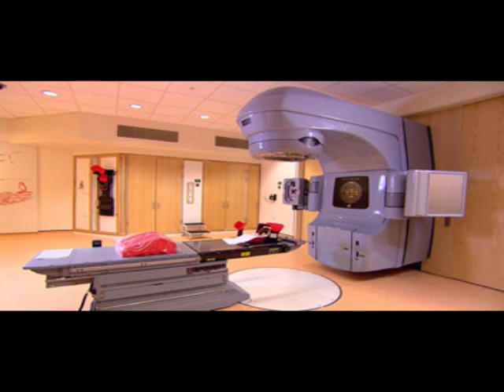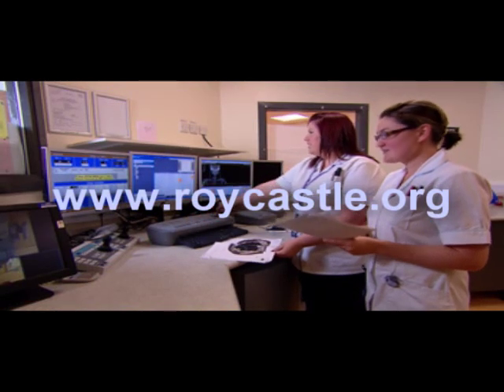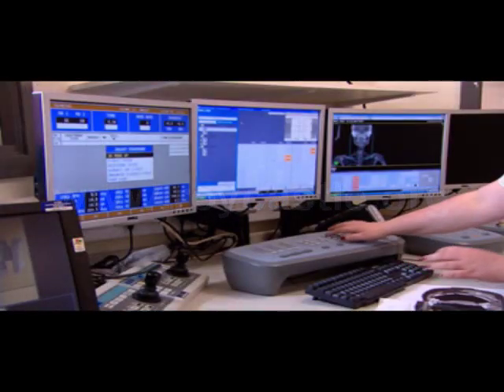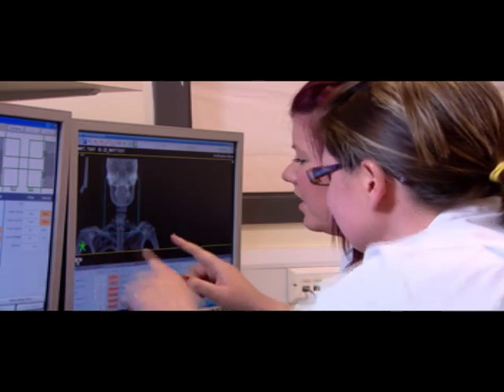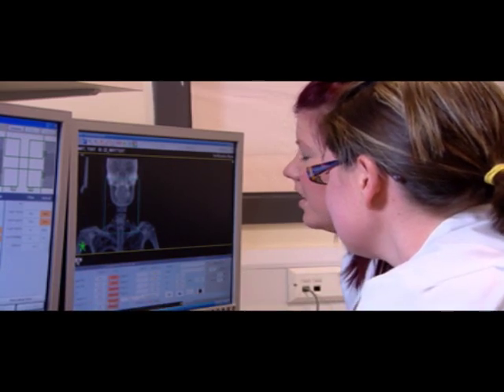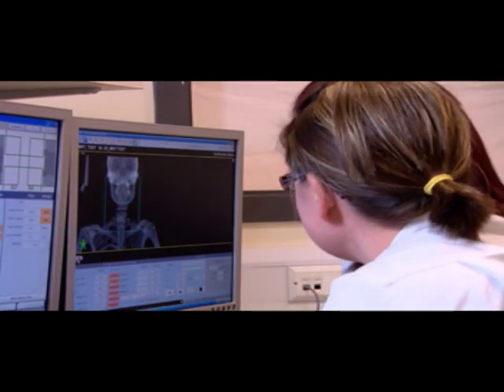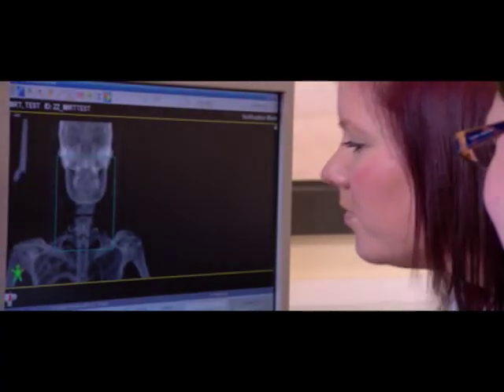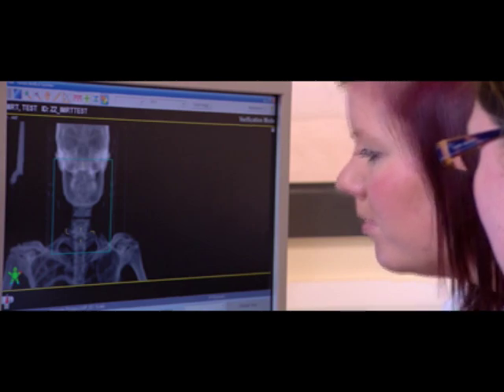Most radiotherapy is administered using a large X-ray machine called a linear accelerator. They work by giving a short external beam directed at the affected areas. Radiotherapy can be used alone as a primary treatment, but it is also used as a secondary treatment. It can be used not only to destroy the tumours, called radical radiotherapy, but also to shrink them and reduce symptoms. This is known as palliative radiotherapy.